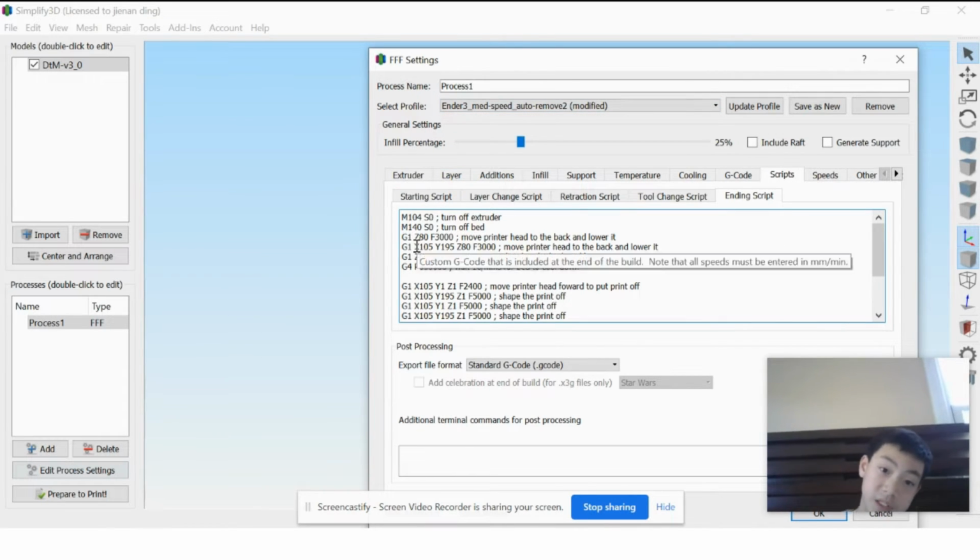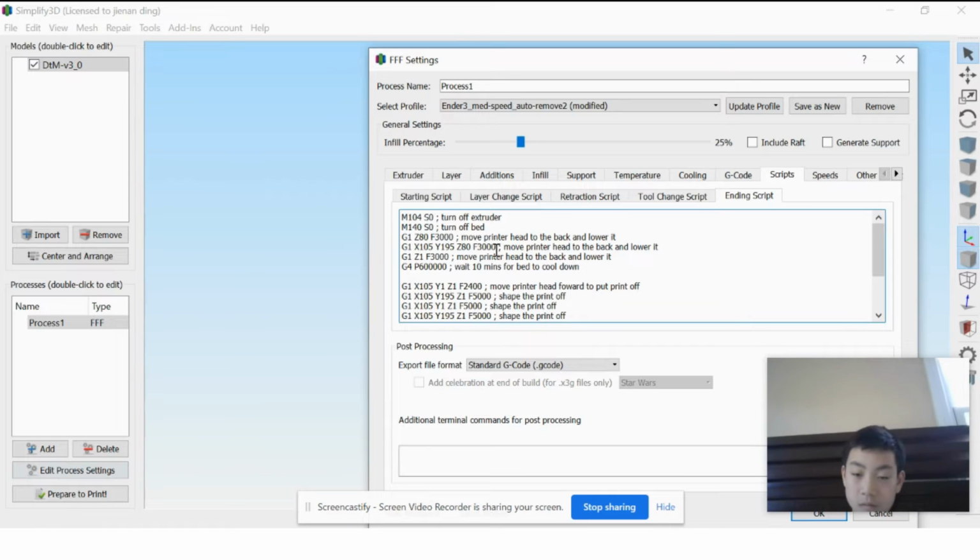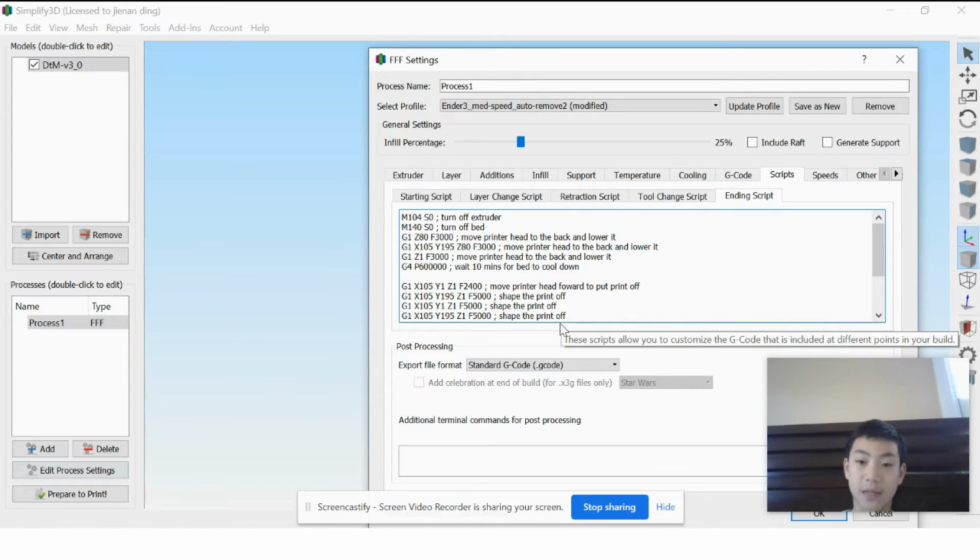So you can just type in these numbers, which are millimeters, to show how far from point 0 you want the nozzle or the bed to move. So this is how you control it. You just write in your script. And P would stand for time. You write it in milliseconds. They use milliseconds because it's more precise for the amount of waiting time.